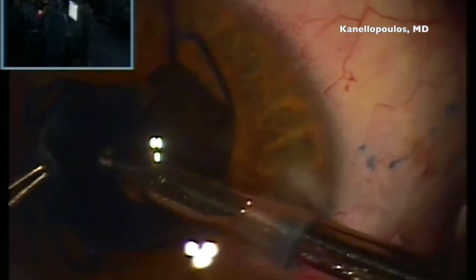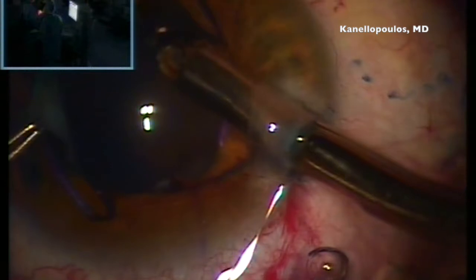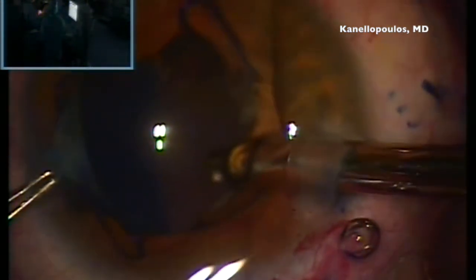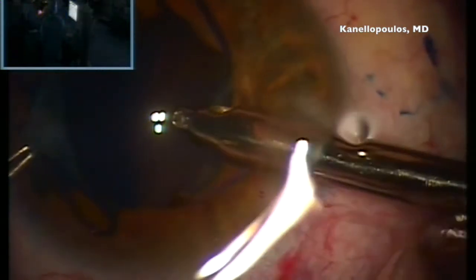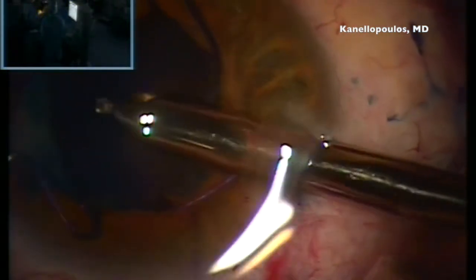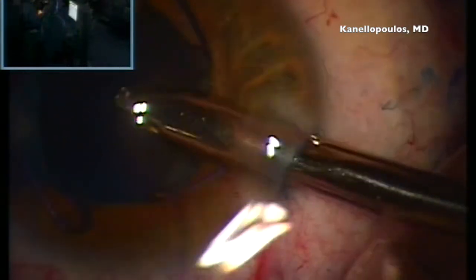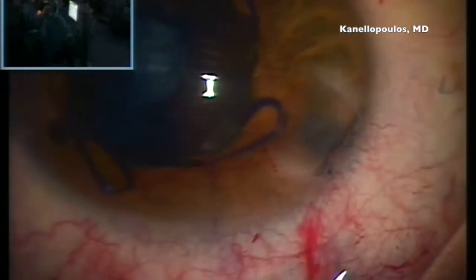I mentioned before that, of course, the easy way is to be a little bit more aggressive with the capsular bag and go with a sulcus placed lens or a three-piece lens of larger diameter. I felt that I want to engage in this patient with the possibility of using a toric lens, since we saw that the indigenous amount of astigmatism is quite large.